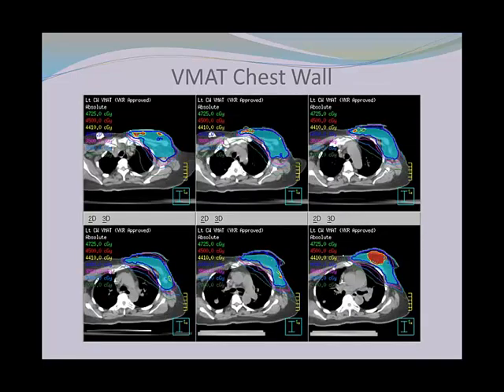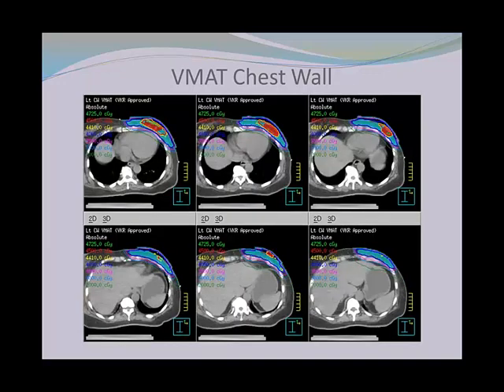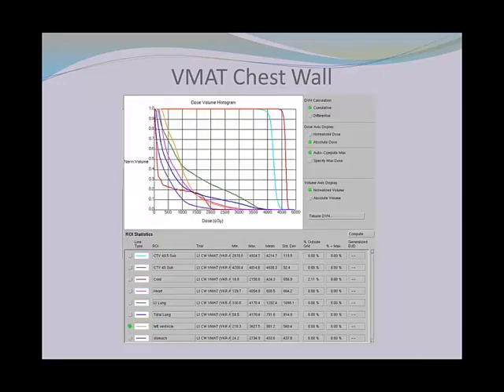During the simulation, the physician will use wire at the CT simulator to delineate the appropriate field border and the surgical scar. Once we CT scan into the treatment planning system, we would contour all the wires and change the density to 0. We do this because the wire can attenuate electron beams. And actually for the previous chest wall cases where you have the IMC and the tangents, we generally also contour all the wires out of those patients too, because you have the IMC field with electron.